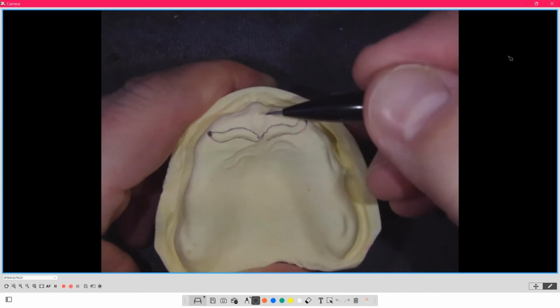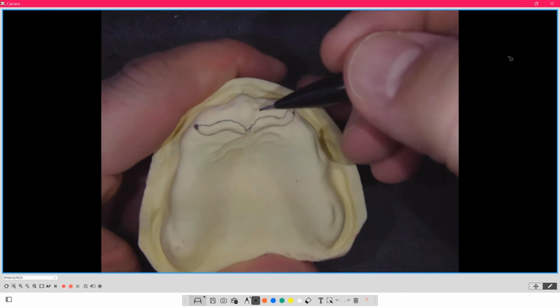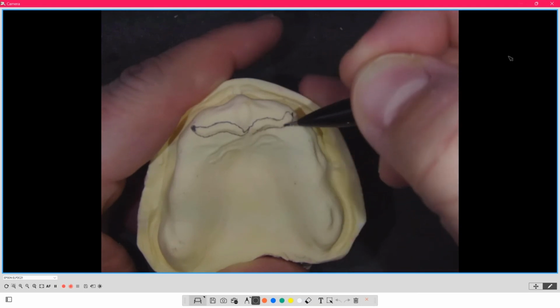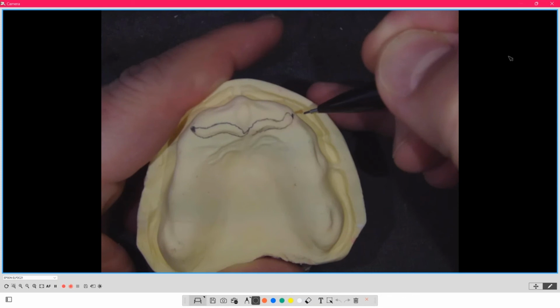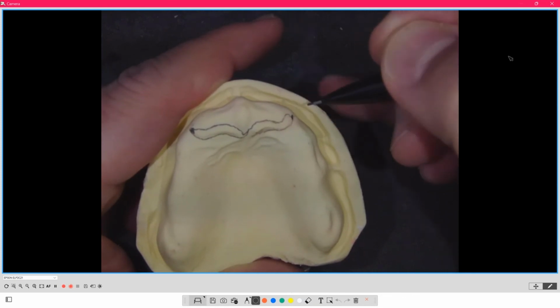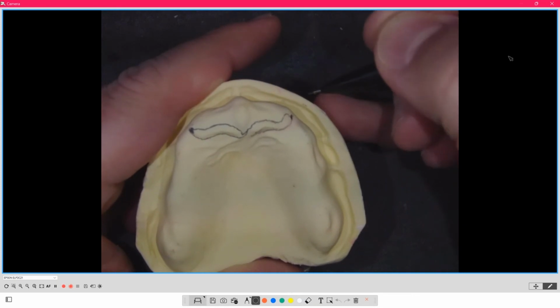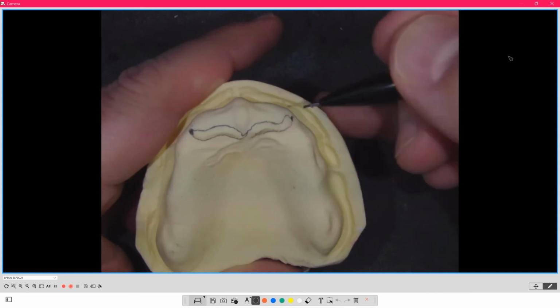So when I do the setup now, even on this type of an articulator and I'm in a lab and I've got to turn and burn, when I start setting the teeth, I still want to make sure that those cuspids are at the end of this long branch rugae, because that tells me that they're in position. Because what's here? The cuspid eminence, which is the bony part. What's here? The corner of their face, right under their nose, so that everything lines up for this person.